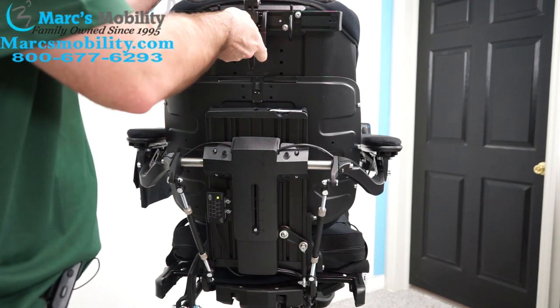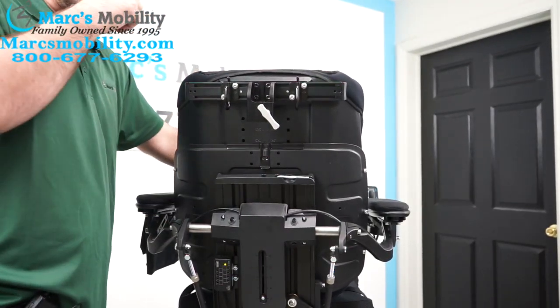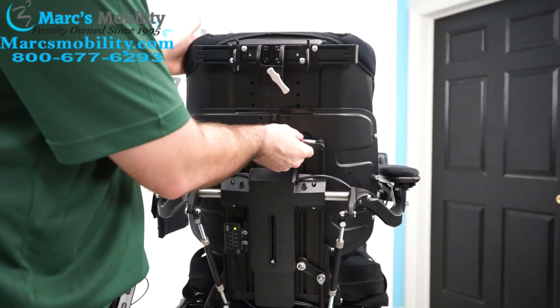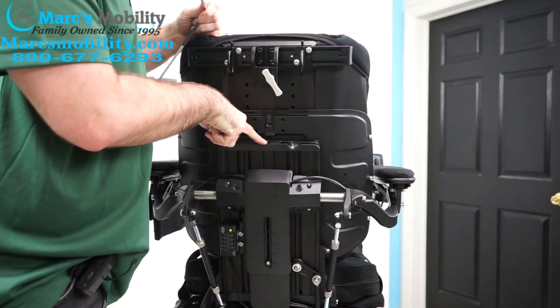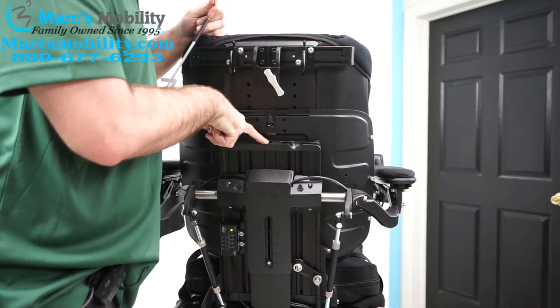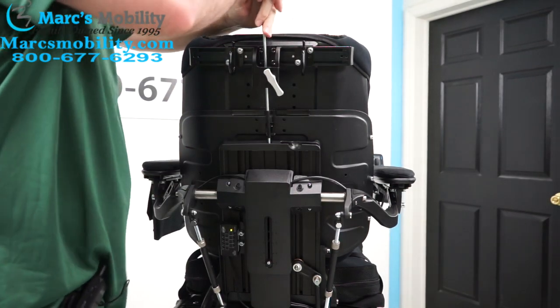Next thing you want to do is remove your headrest. Then this is where you'll use the tool you have back here. There's a screw right here that's going to adjust your up and down. You're going to take your tool and get it in there.